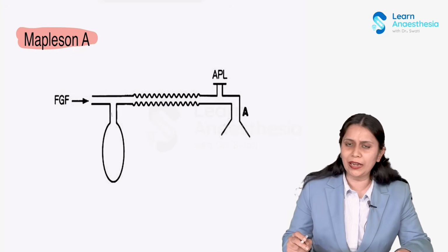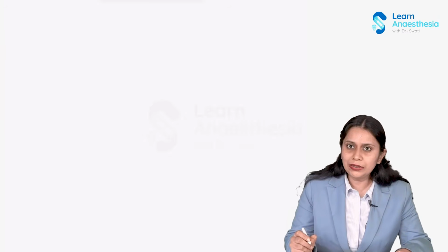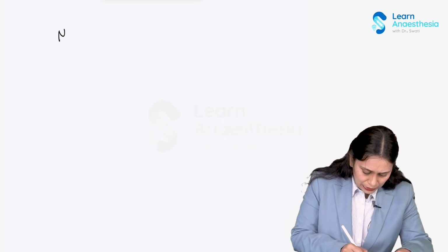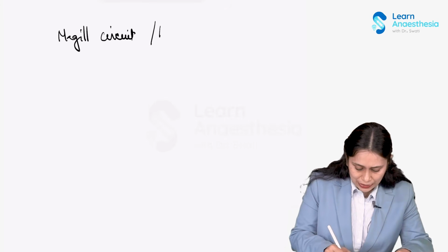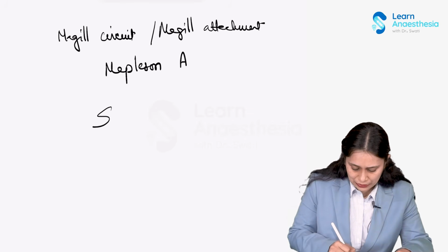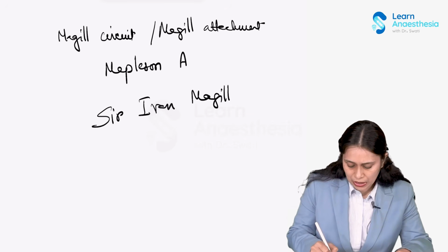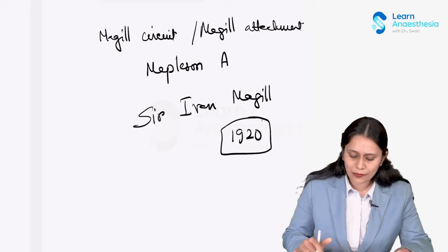This circuit was designed by Sir Ivan Magill, so this is also called the Magill attachment or Magill circuit. This is what is your Mapleson A. And this circuit was designed by Sir Ivan Magill in 1920, right? 1920.